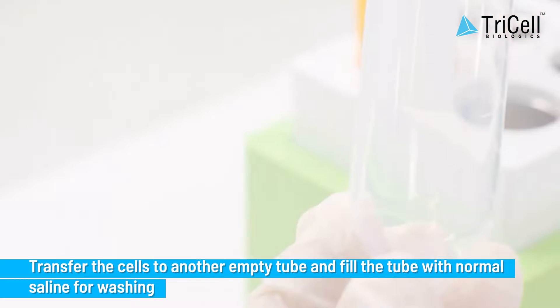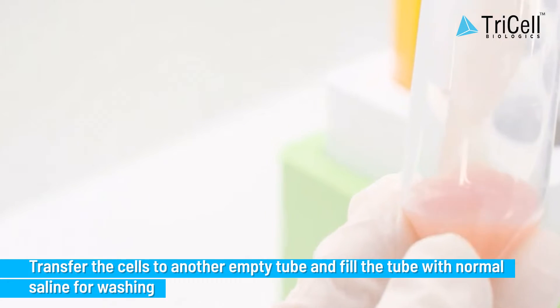Step 9: Transfer the cells to another empty tube and fill the tube with normal saline for washing.